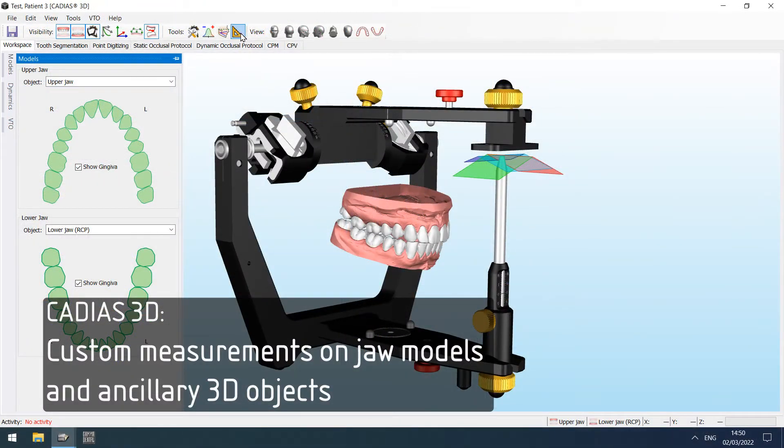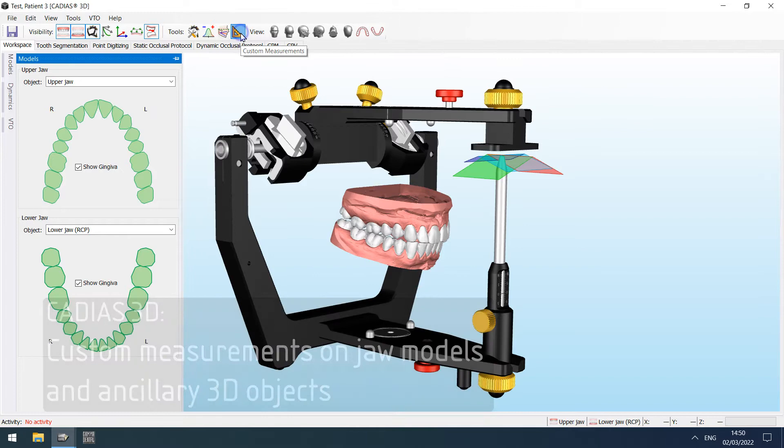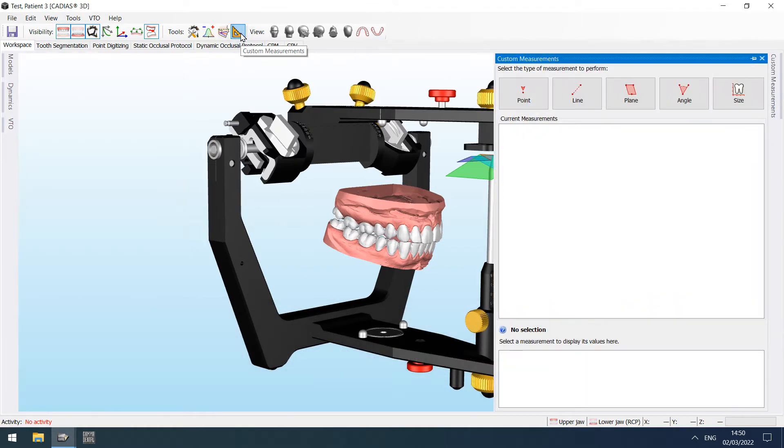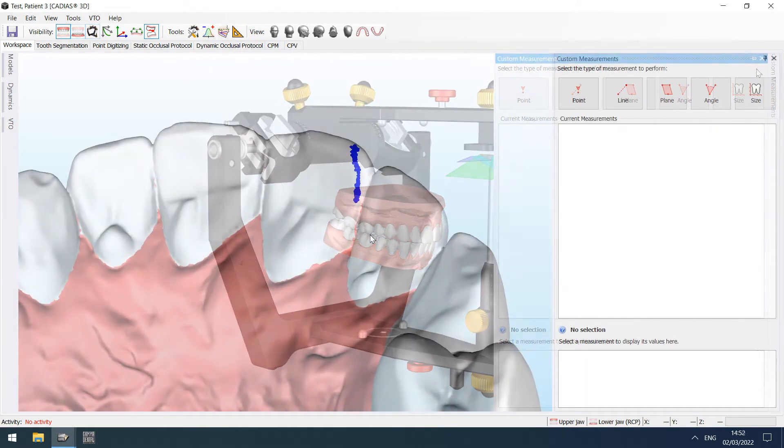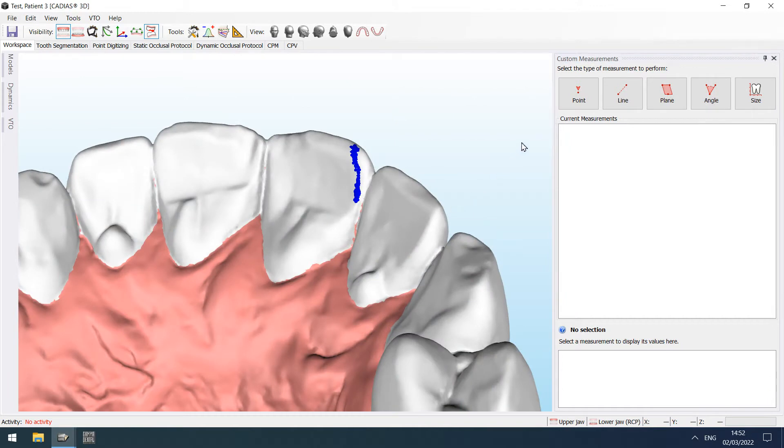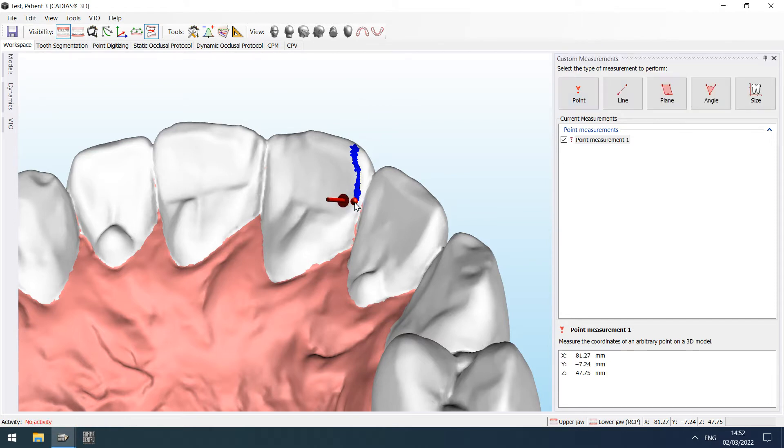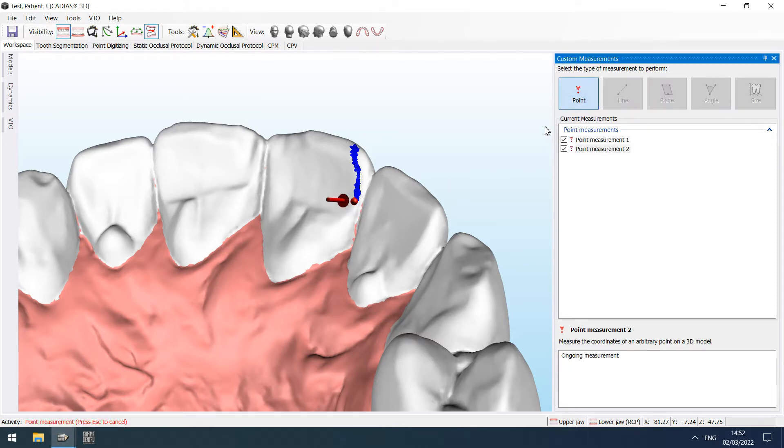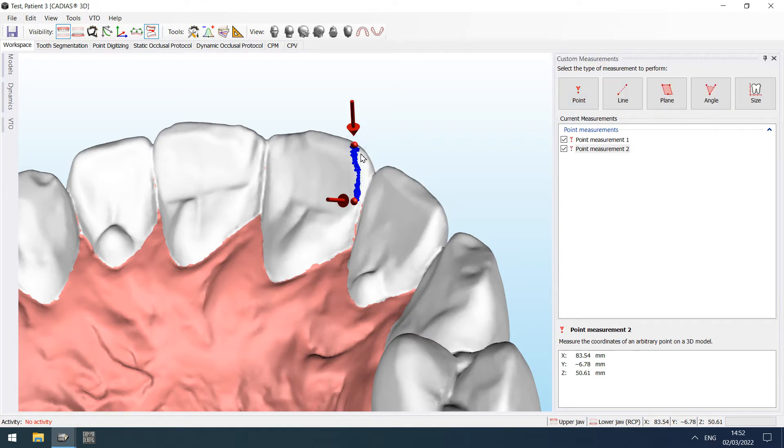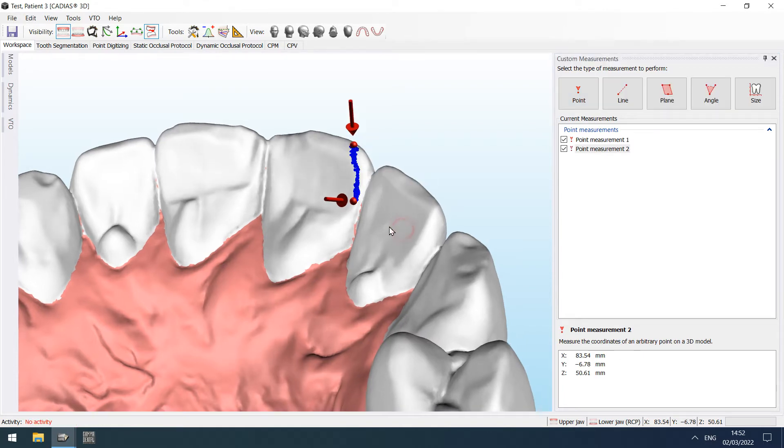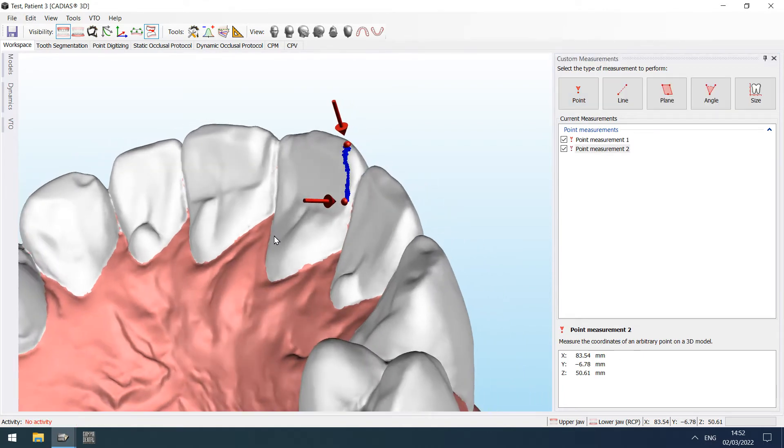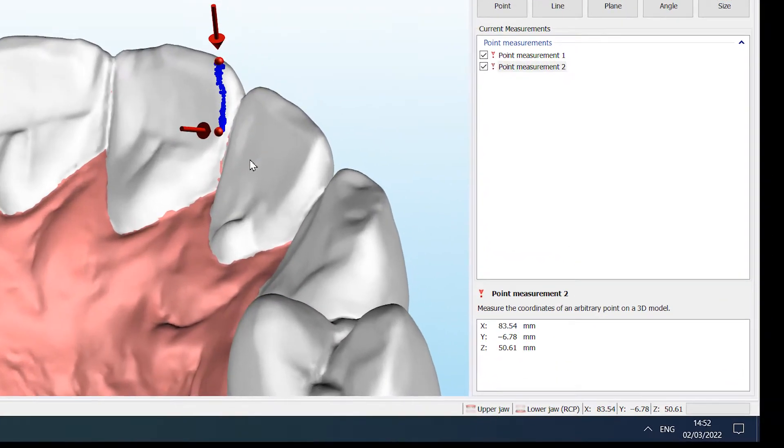Cadia's 3D now provides an additional tool window for custom measurements on the displayed 3D objects. Using this tool, it is possible to perform point measurements. All the results are shown in the right bottom of the screen.